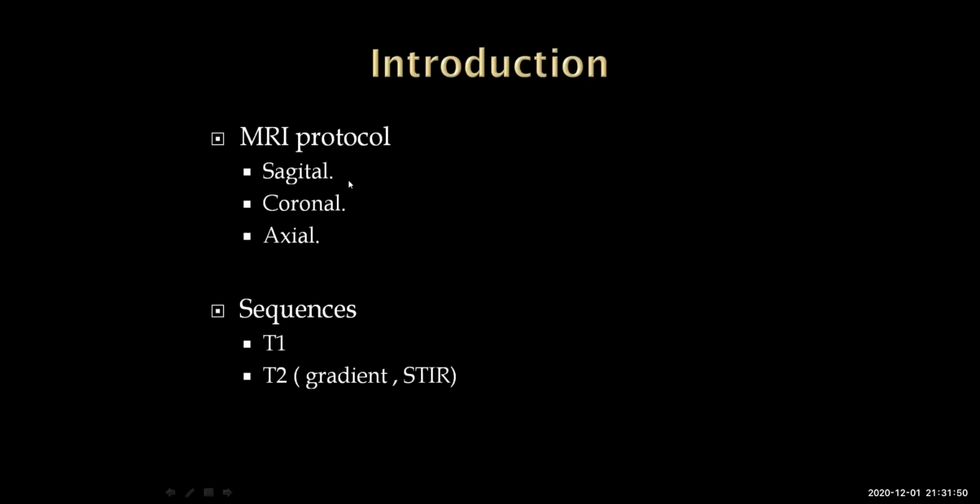But nevertheless, do not accept a cut which is really not well done, or a badly taken slide, or a missing slide. This really puts you in a dilemma. This is why I think most of the clinicians here don't rely much on the MRI. I don't think they don't know, but they do not reach a conclusion because the cuts are not complete. So we need to train ourselves in how to read an MRI with the proper MRI protocol.